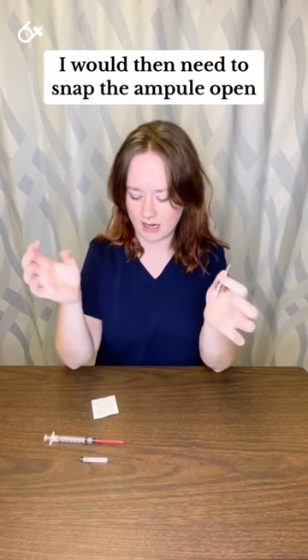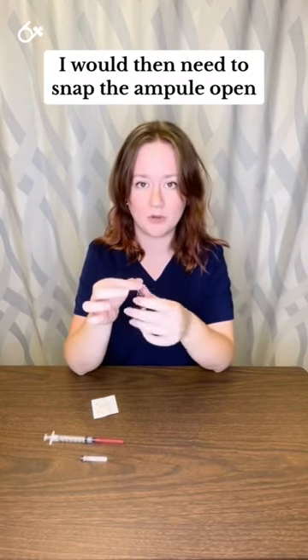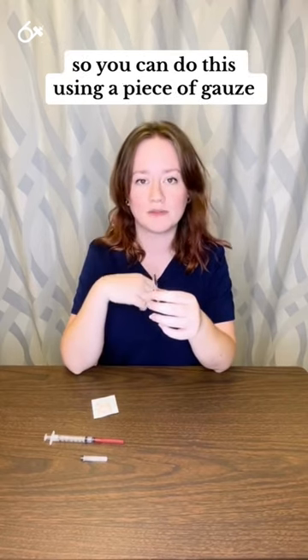Once that's done, I would then need to snap the ampule open. You can do this using a piece of gauze, like a 2x2.